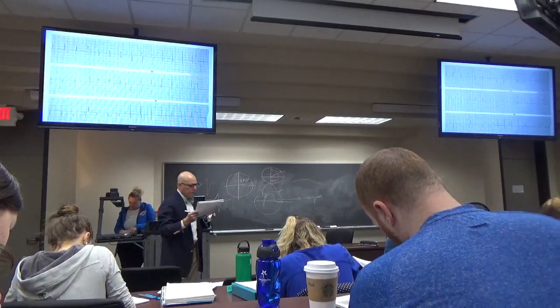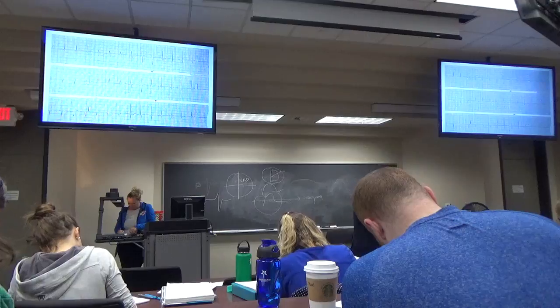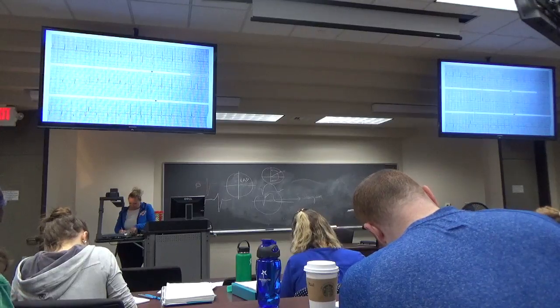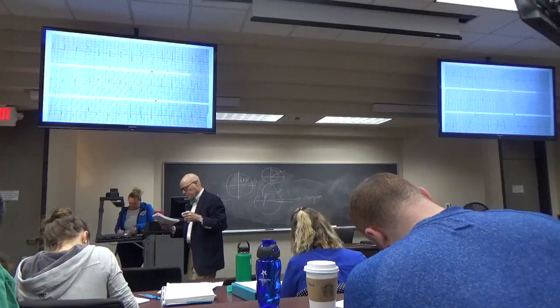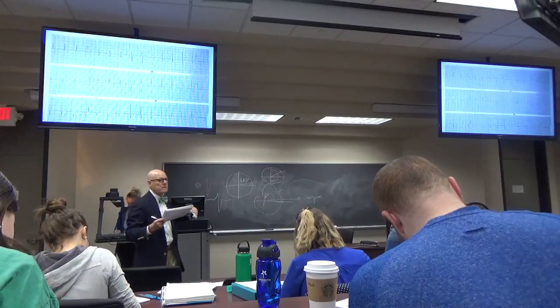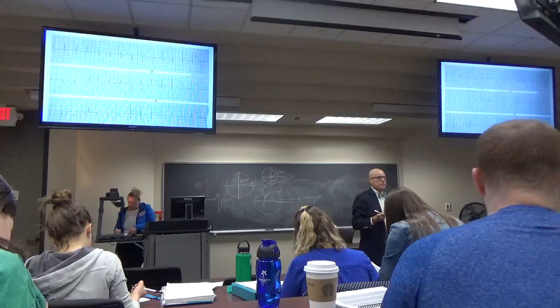Problem is the inferior wall MI looks old. And the lateral wall is either recent or age undetermined. T waves are still flipped upside down in the lateral wall, so there may be different times. The inferior infarct looks old because the T waves are upright and the ST segment's on the baseline. Any other questions about 30?